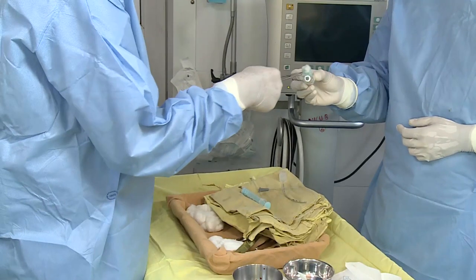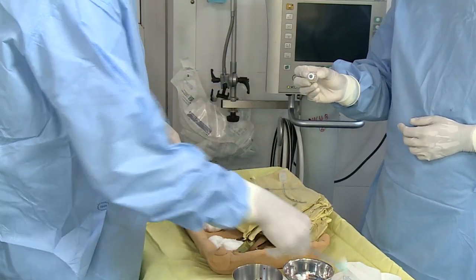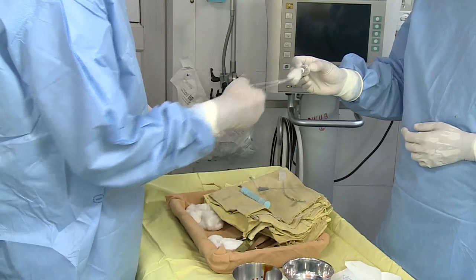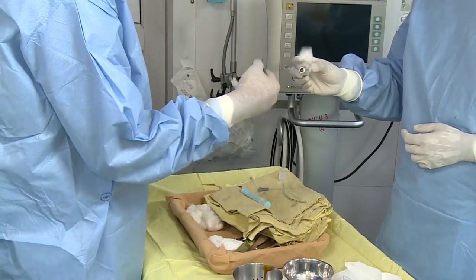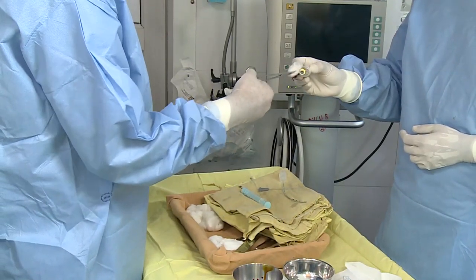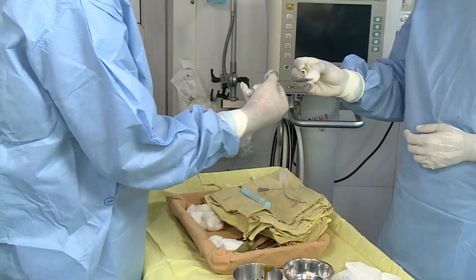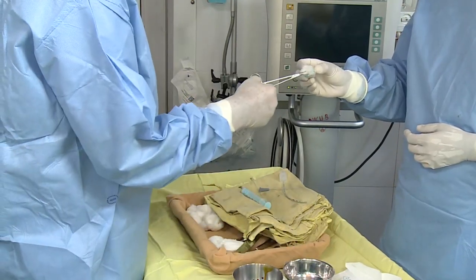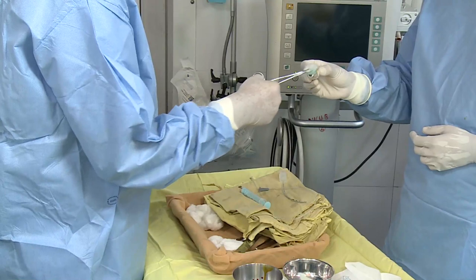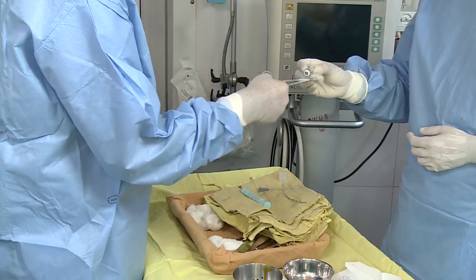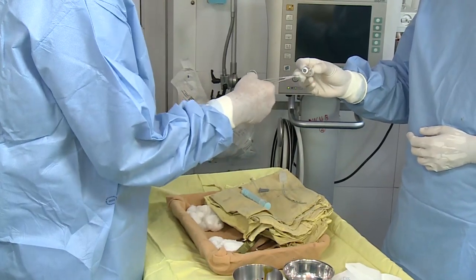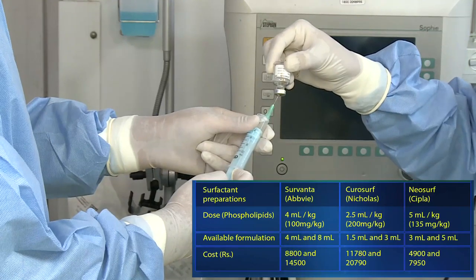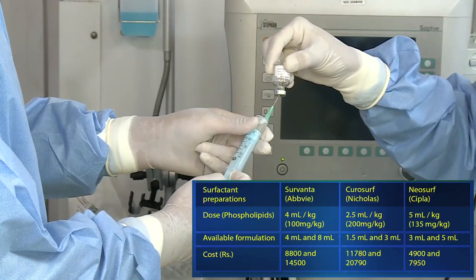Using the three-swab technique, clean the surface of the surfactant vial. Load the drug in the prescribed dosage into a 5 ml syringe. Do not shake the bottle to prevent formation of excessive froth.